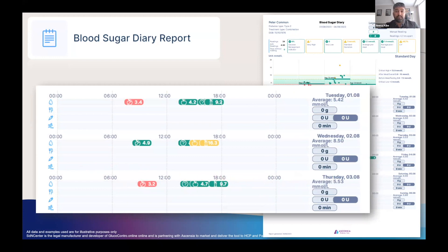If patients have been using the Contour Diabetes app and recorded their food, medications or activity, this will also show up on the report, allowing for a more complete picture. In the right-hand side columns for each day, it shows their average blood glucose reading for that day, allowing you to see how this varied from one day to the next.